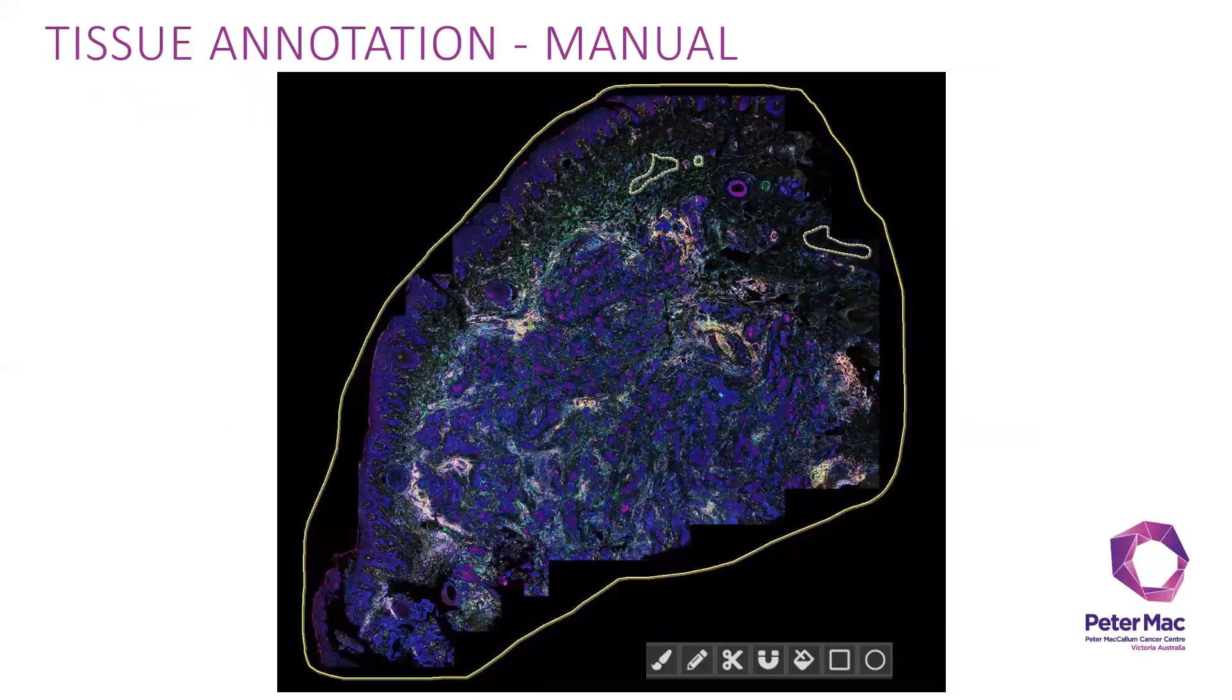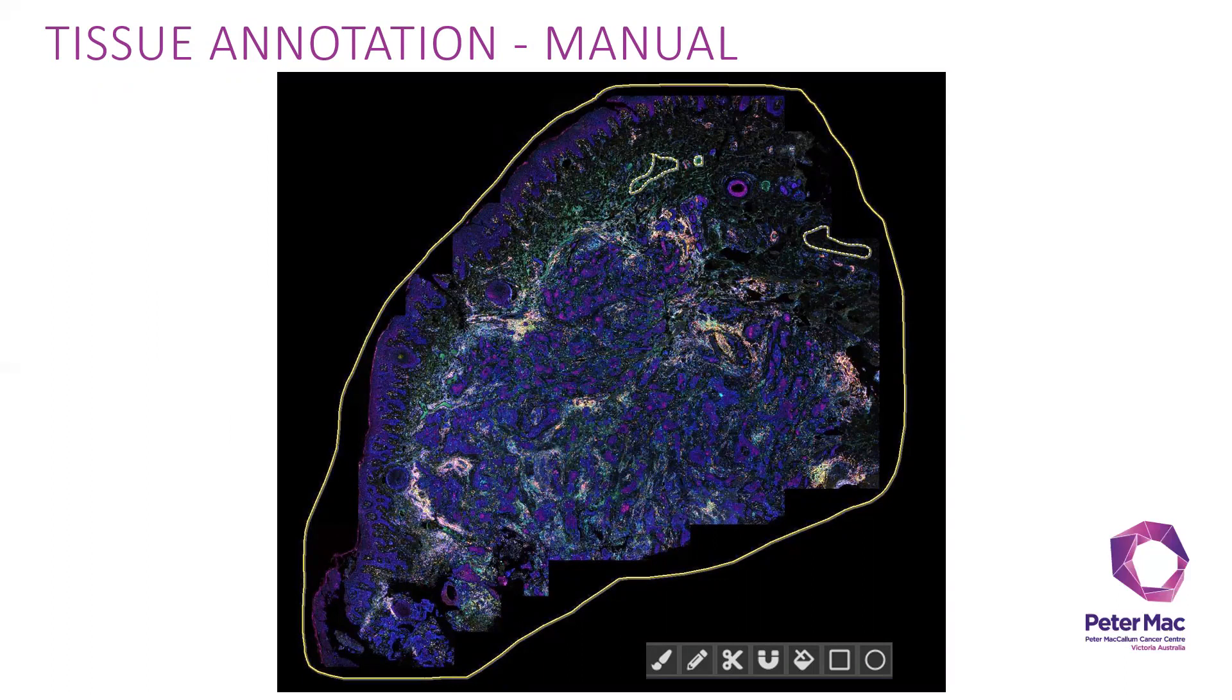Manually, in here I have drawn the annotation around the tissue as shown with the solid yellow line. And I have drawn a couple of areas that I would like to exclude from the analysis as shown with the yellow marching ant line here.